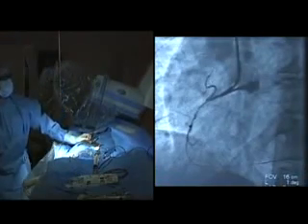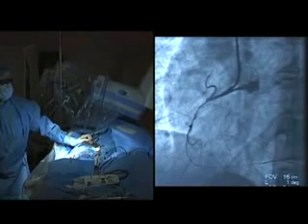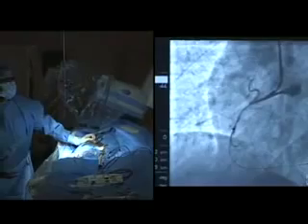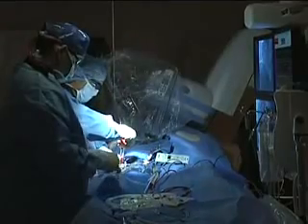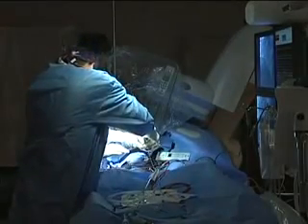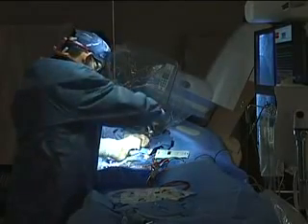Through the catheter with negative suction, we'll attempt to remove the clot that caused this artery to block. Then we'll take a look at the artery and see how it looks. The artery is now open — it just looks small. Now that we've restored flow, we're going to use a balloon to open up the artery and use some nitroglycerin to relieve spasm. After balloon inflation, we still see a lot of thrombus in the vessel past the blockage, so we're going to put the export catheter back down and withdraw a little bit more clot.